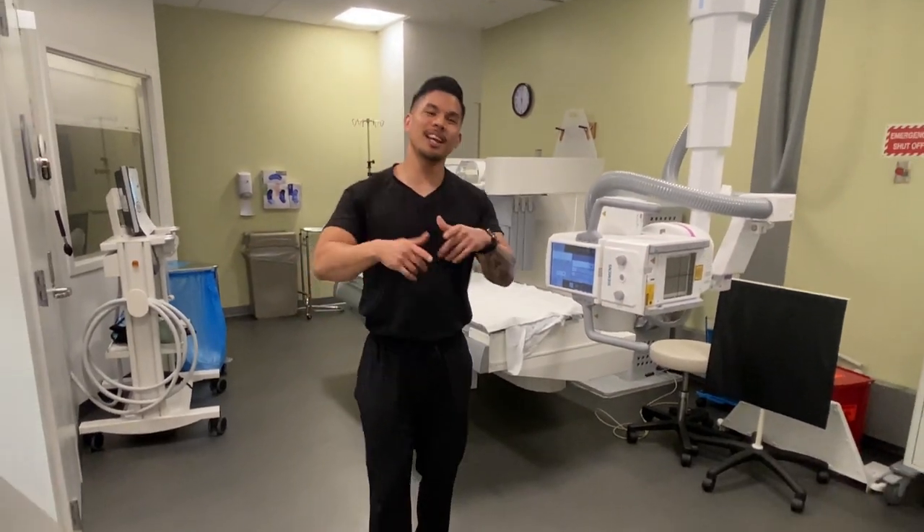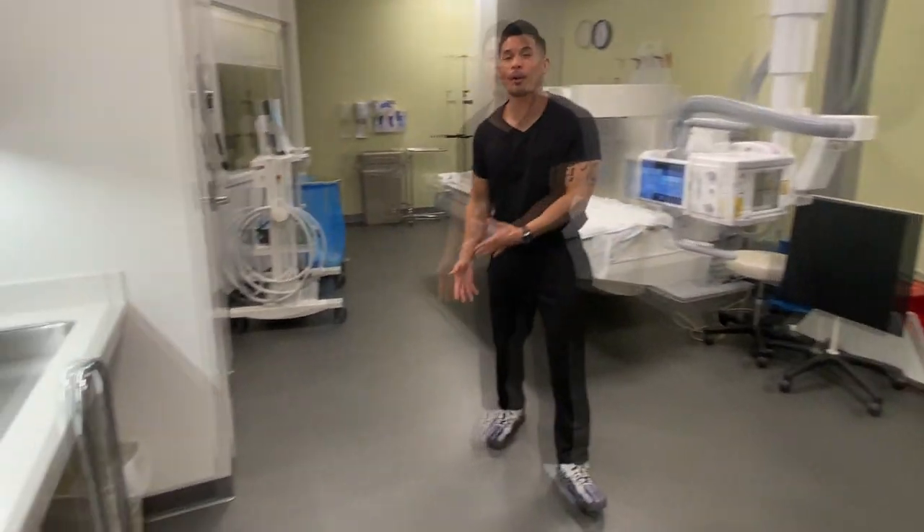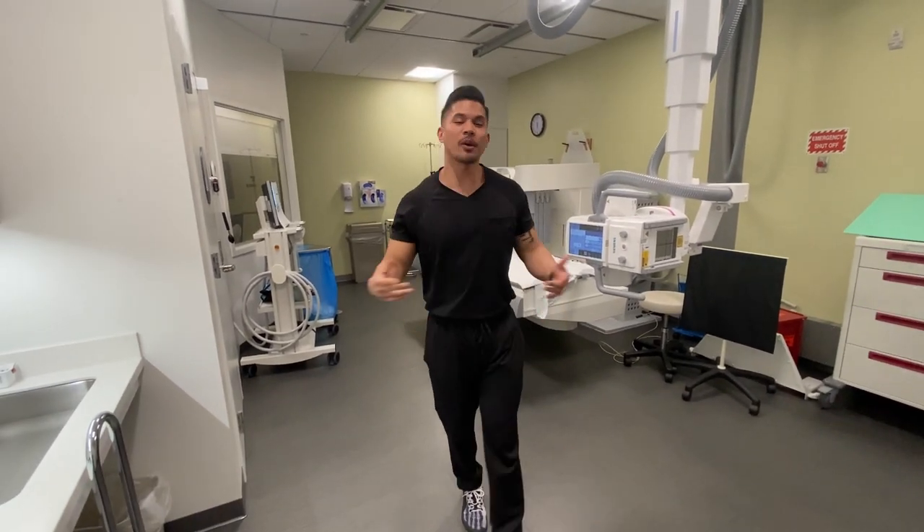What's going on YouTube, my name is Ray and I'll be taking x-rays. Welcome to my turf, my court, my playground. What do you say we work on some positioning? Let's go, let's get it.